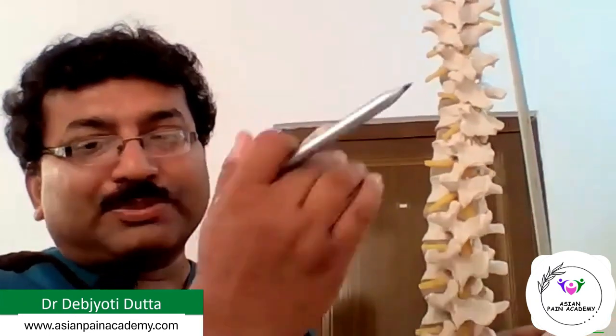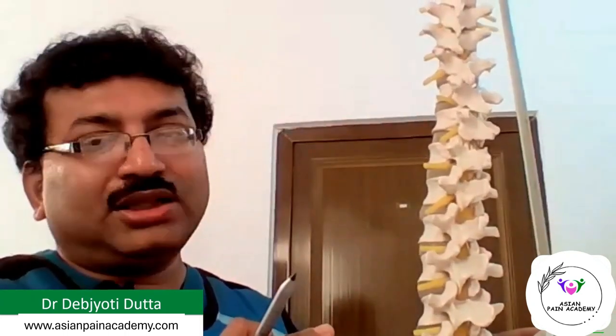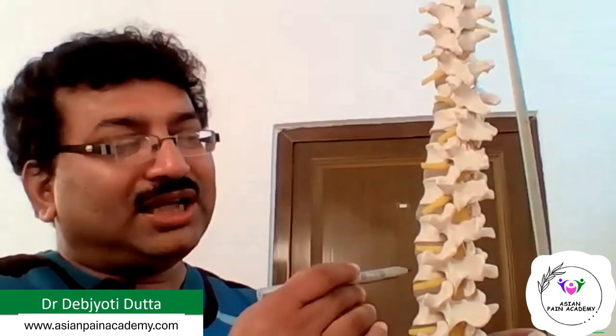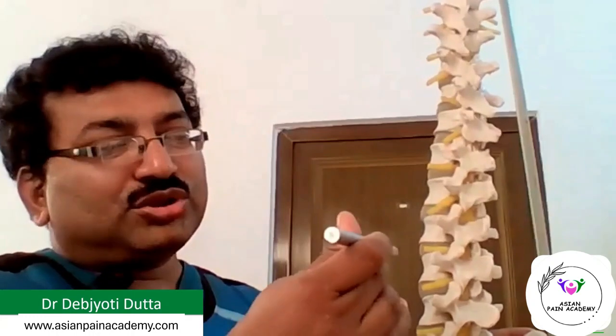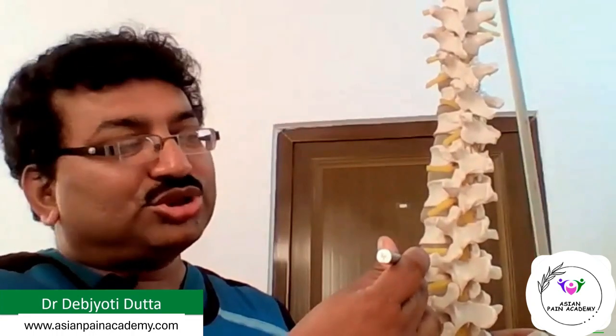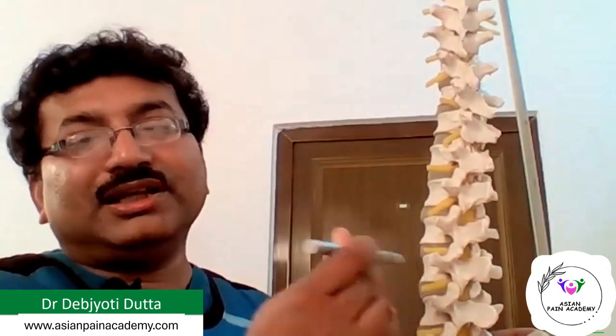Now if he rotates, that means we are making the C-arm oblique. Now in this position, you can see the transverse process is within the vertebral body. So if we go by making a tunnel view like this, we will reach the area. We are going to do exactly the same in the C-arm.